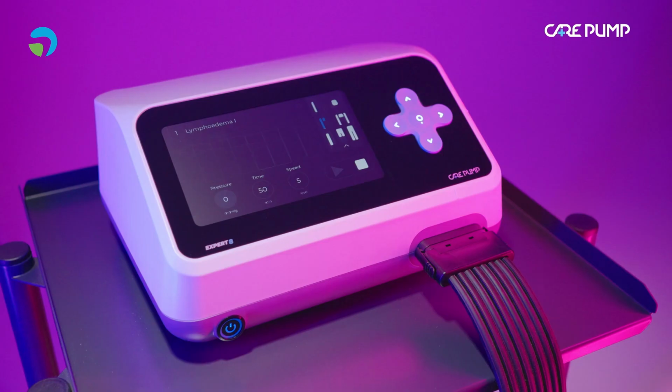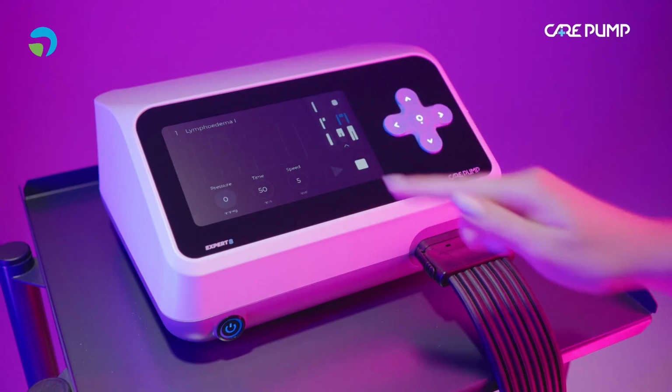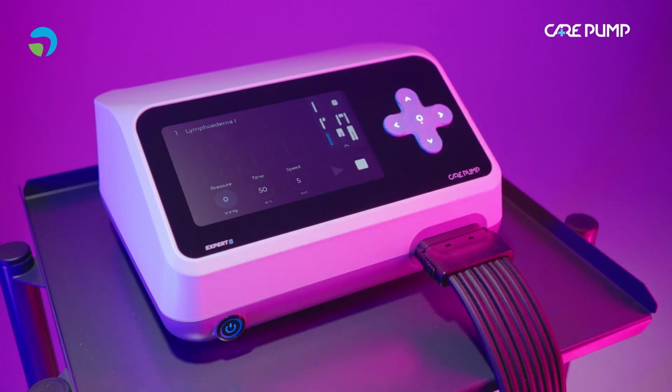Cuff selection. You can monitor the course of the treatment on the cuff visualization shown on the screen. To select the correct cuff, touch the human body icon and select the appropriate body part. The screen will display the selected cuff divided into numbered chambers.